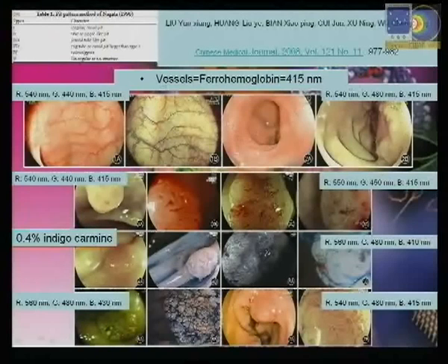Here is one of the cases of chromoendoscopy. It is clear that without changing the wavelength, you see less; by changing the wavelength, you see more. In this case, it's not a problem because it's just to see more or less the vessels, but obviously it's much more marked here, and the only difference is just the color excitation of the light.